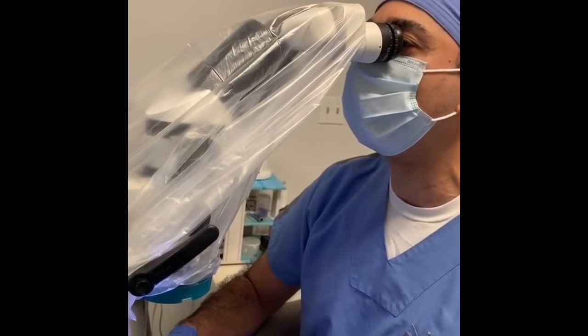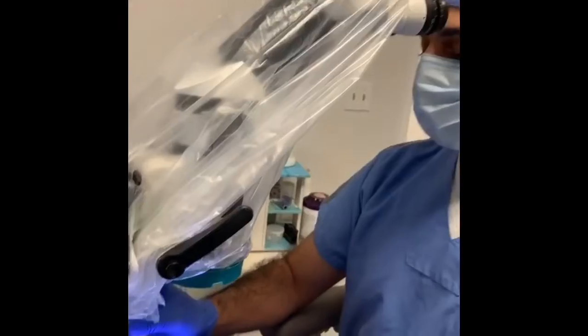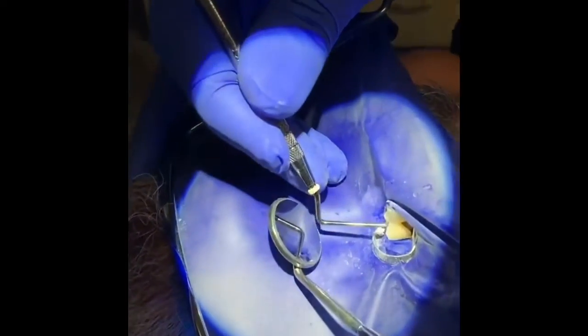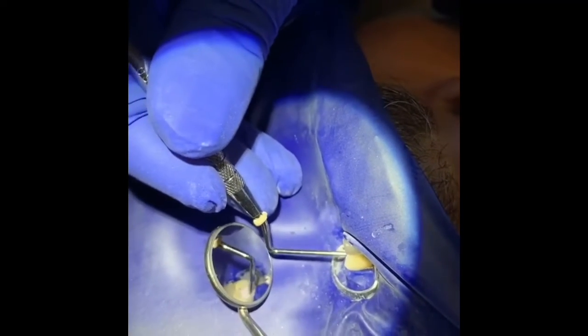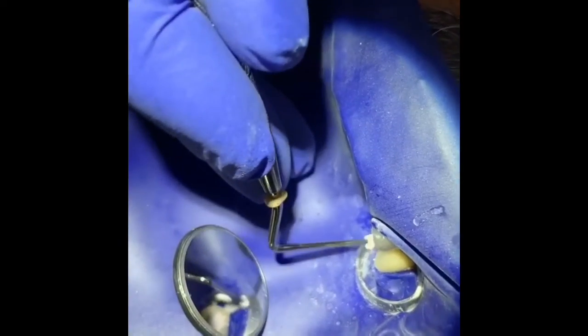I put a piece of sponge in followed by Cavit, and we're cleaning everything up. I'm going to activate the Cavit with just a little bit of sterile water to make sure the tooth is sealed properly.